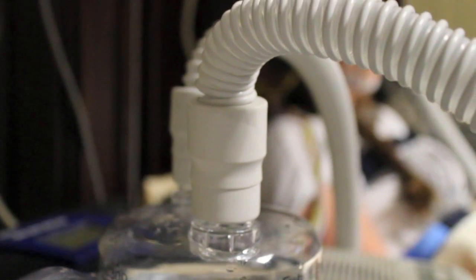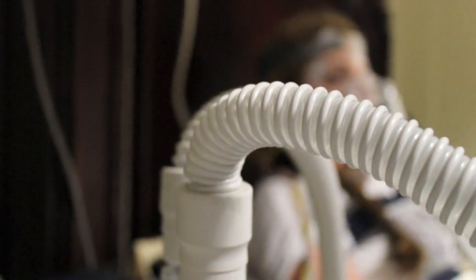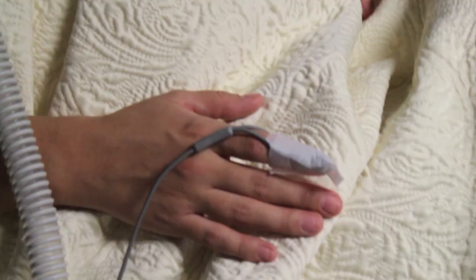If it's an obstructive apnea, we will see airflow stop but we still see an attempted effort from the two belts that you're wearing around your chest. We look at the oxygen saturations, whether those are going down and whether those events are scored.